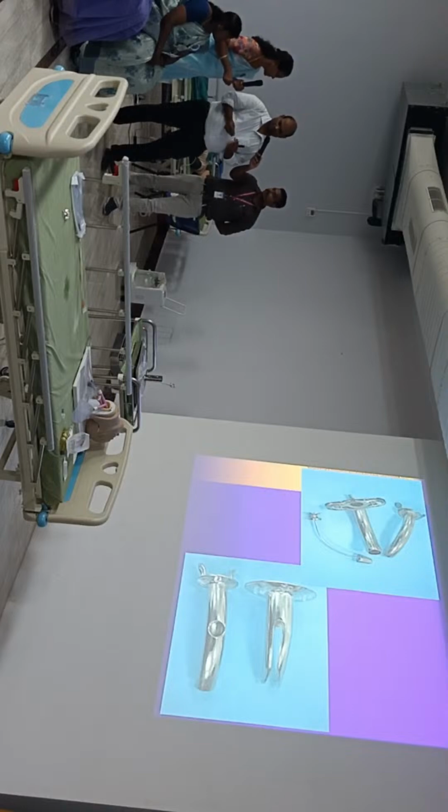Okay. So this is a biflange tube. You can see two flanges here, no? Yes, yeah.